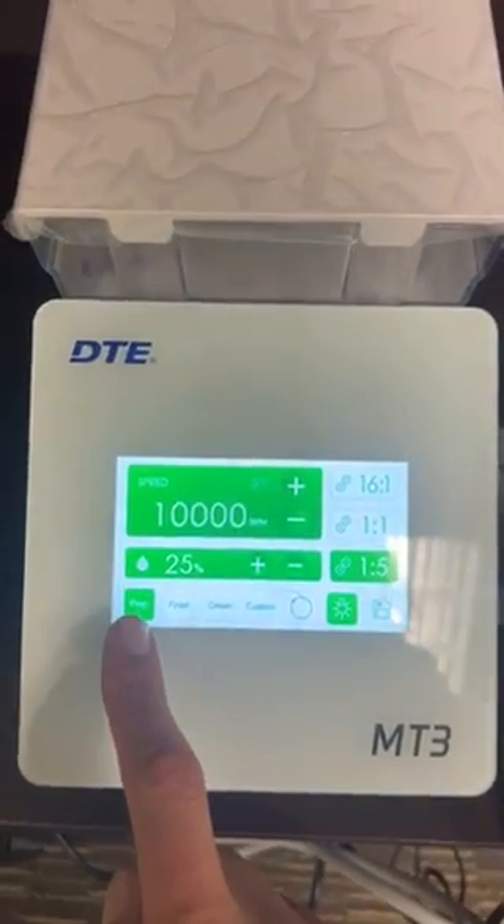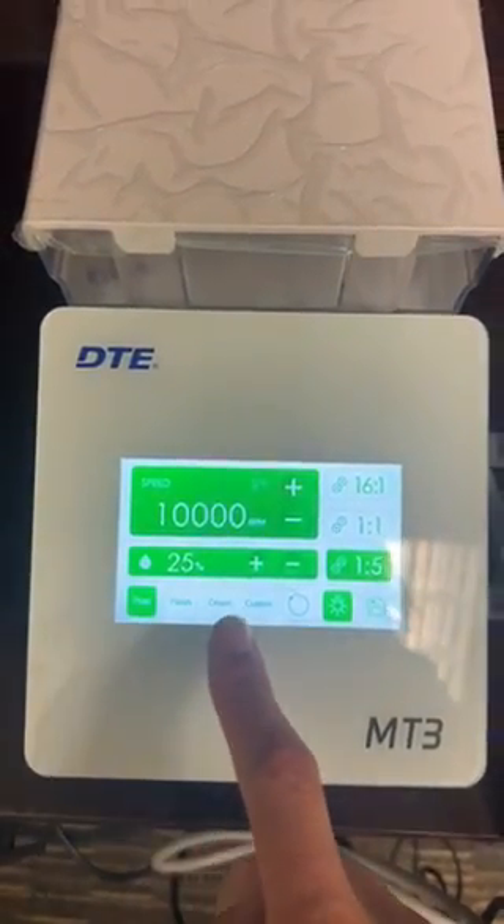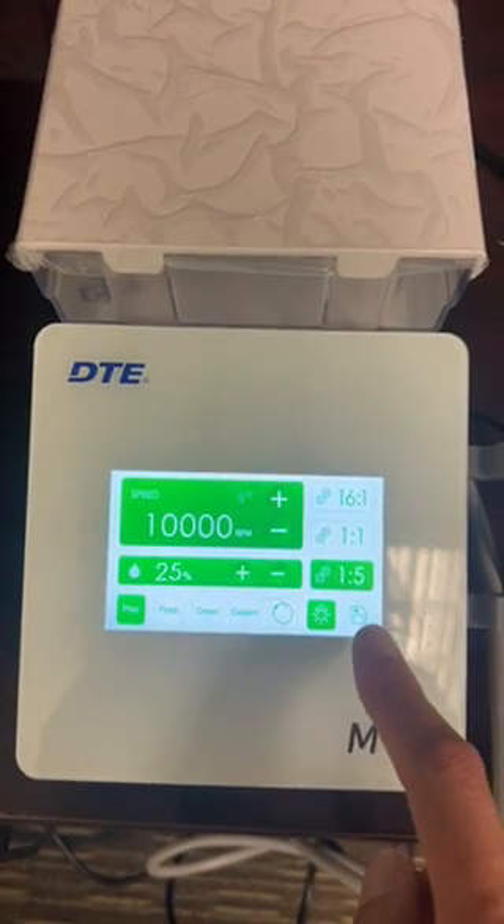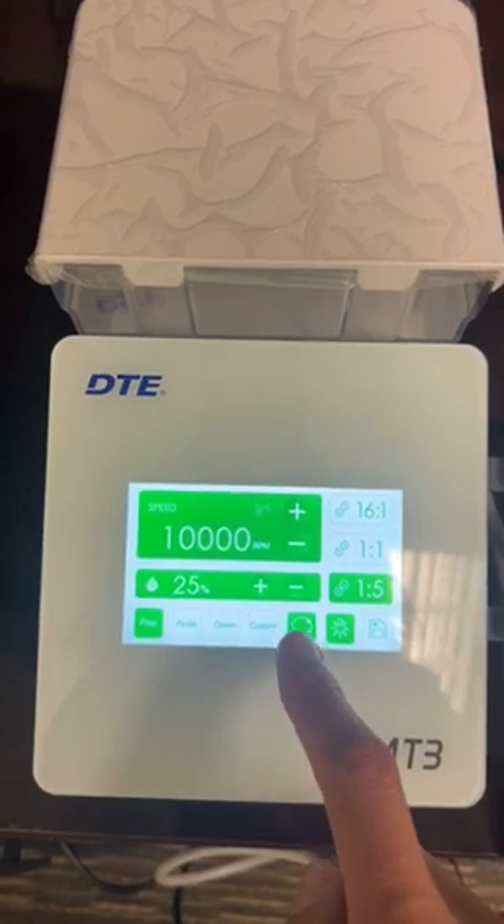Right here you have: prep, finish, crown, custom — you can set up some memory spots here. And then light, light off, and reverse.